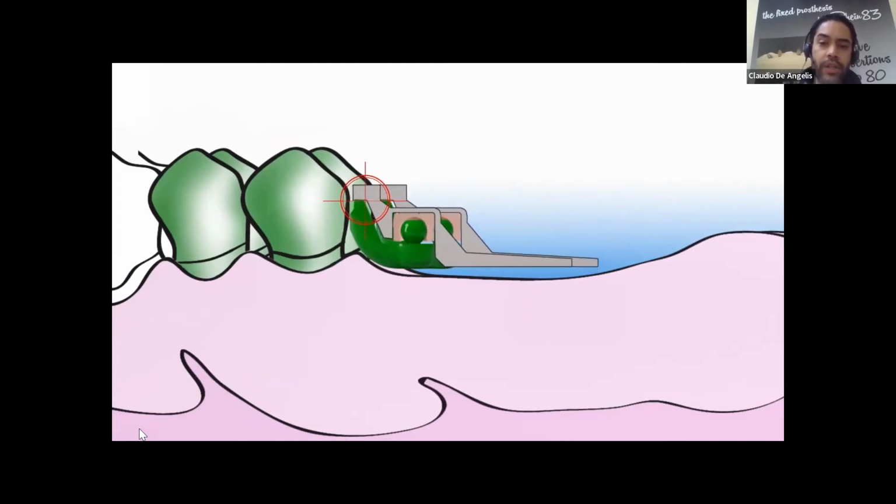Why? Because on the distal area, you have the chewing force. Around the sphere, you have the elasticity of the retentive cap, and very close to the crown, you have the fulcrum of all this system. By doing a proper job, all the stresses will be located over the fulcrum, which is very close to the crown. If you do not respect the arm of my attachment, what will happen?